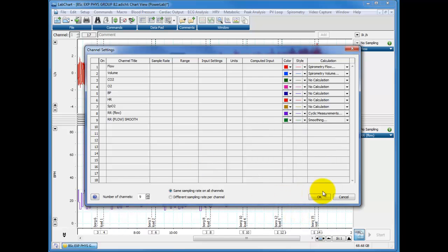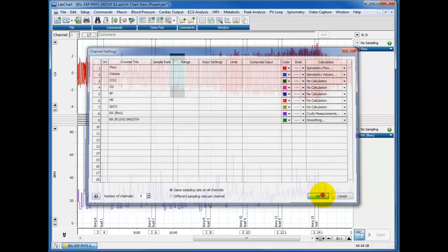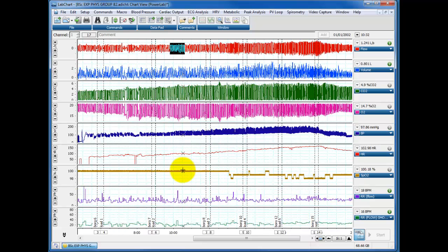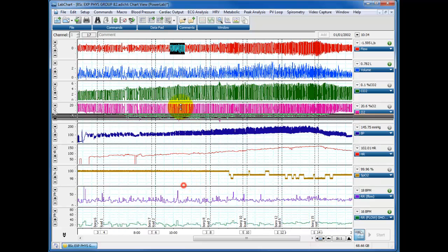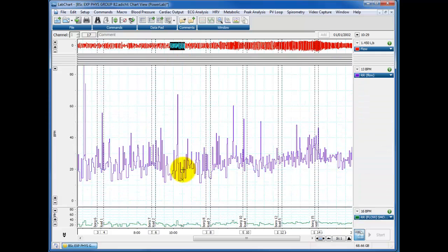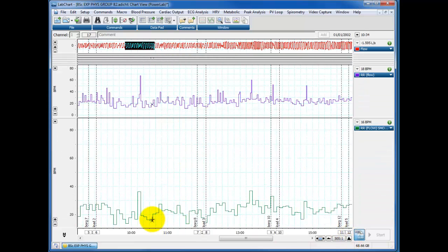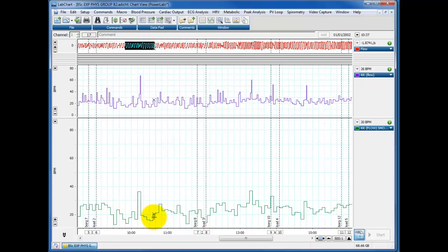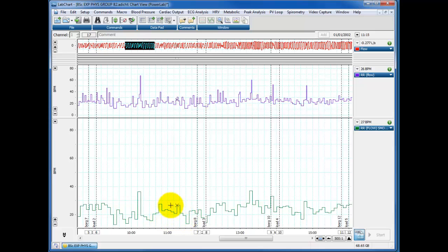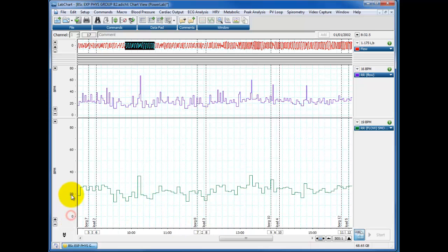So what the software will now do, if we see the data here, if I just zoom that up to there and have a little look, you'll see what it's done is it's taken bins of five seconds and it's averaged the respiratory rate over those five seconds. So each of these little bins here is a five second period. You can see it jumps from bin to bin to bin, but that's because the average has increased.